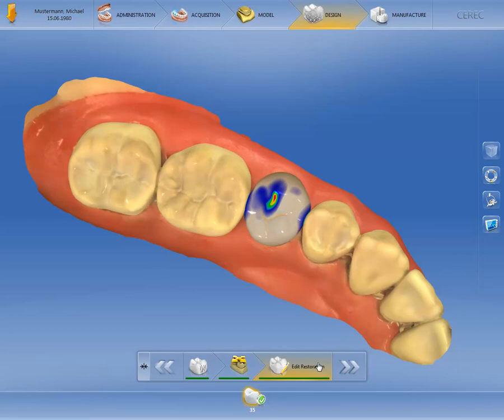The areas colored from blue through green to red show clear penetration of the occlusal contacts to the antagonist. The profiles selected in the design phase only relate to the current restoration and are not applied for subsequent patients or cases.